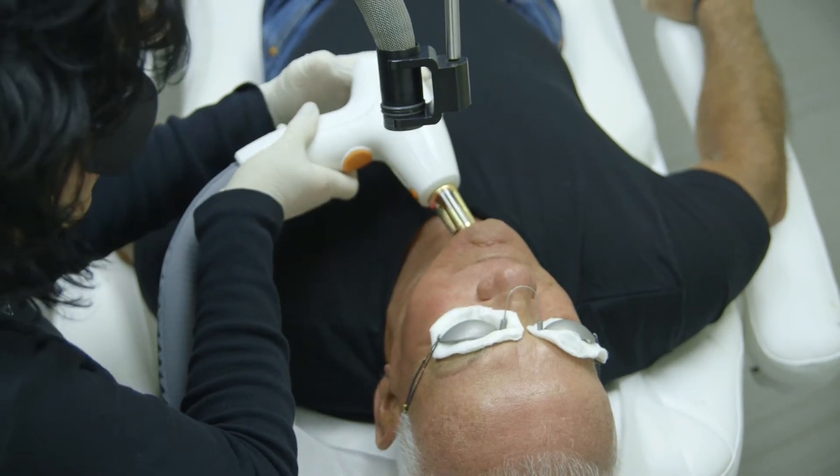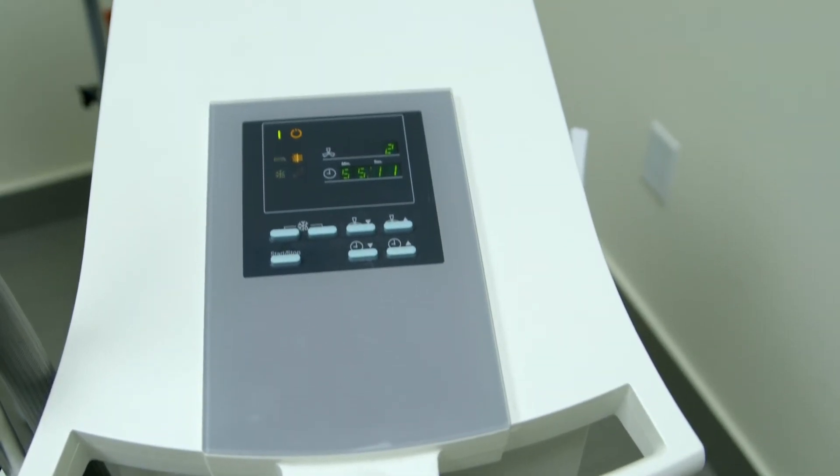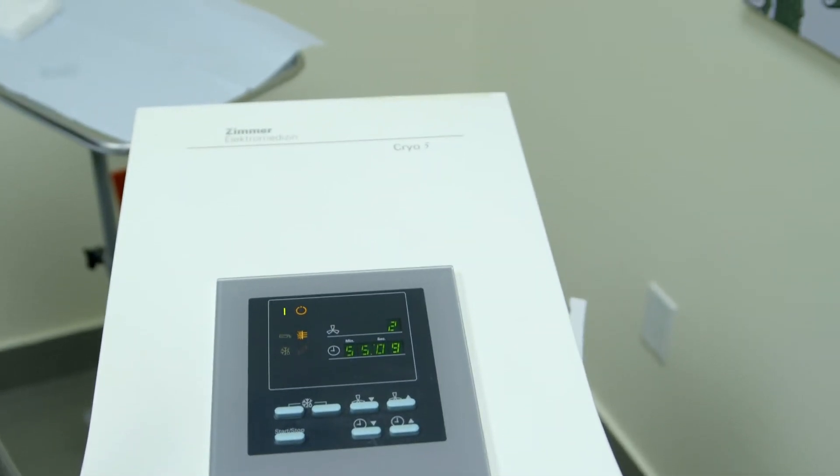Each area of the face is treated depending on the condition and also the thickness of the skin. While we're doing the procedure, we use a chiller or Zimmer to help make the procedure more comfortable for the patient.